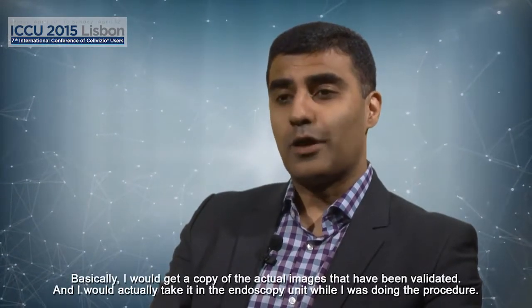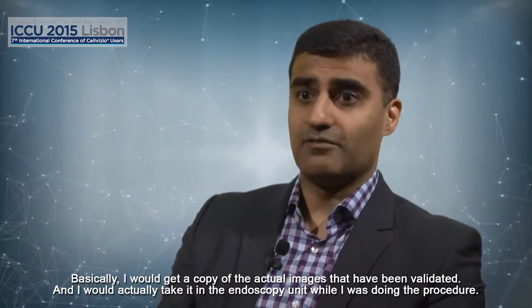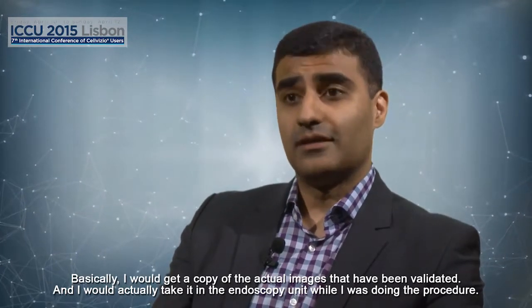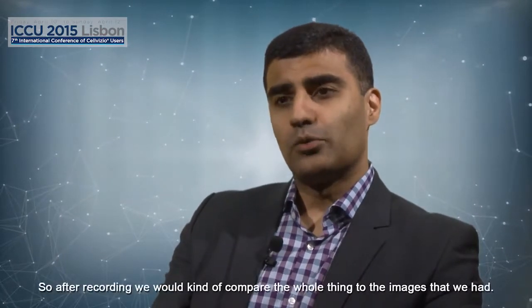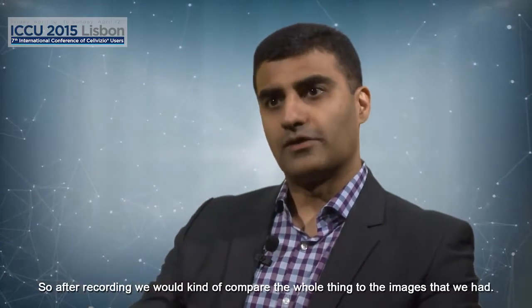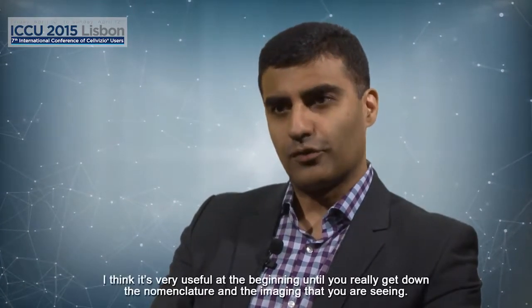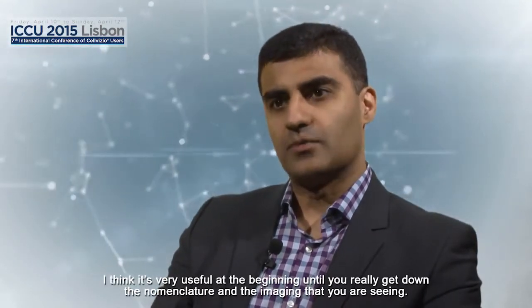Basically, I would get a copy of the actual images that had been validated, and I would actually take it in the endoscopy unit while I was doing the procedure. And so we would, after recording, compare the whole thing to the images that we have. And I think it's very useful in the beginning until you really get down the nomenclature and the imaging that you're seeing.